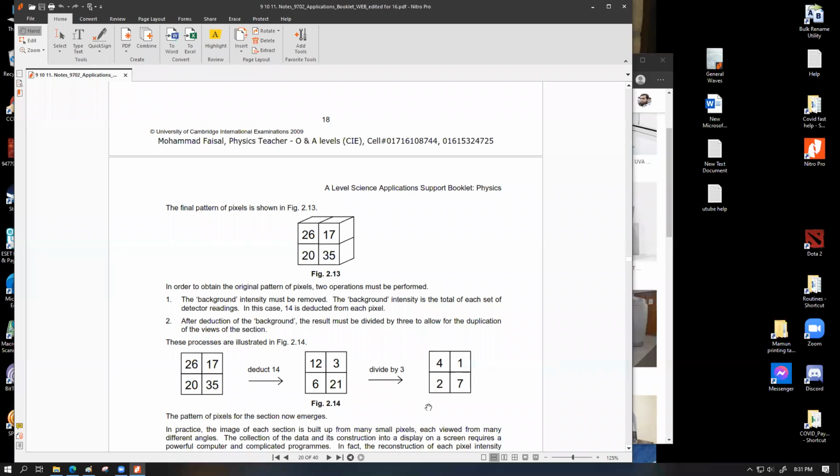This is what we are going to get out of this whole process. And now we know that these 4 individual tissue pieces that we are trying to scan through CT scanning have these pixel intensity values. Initially, we did not know this. You have to understand this. We came to know about these 4 individual values after doing all of this calculation. We did not know these values to begin with.